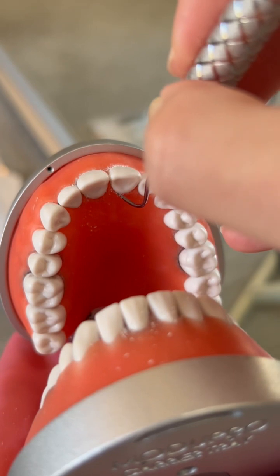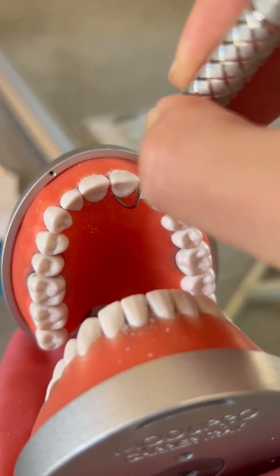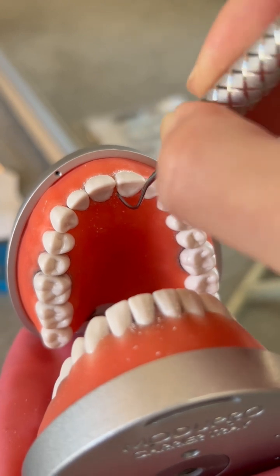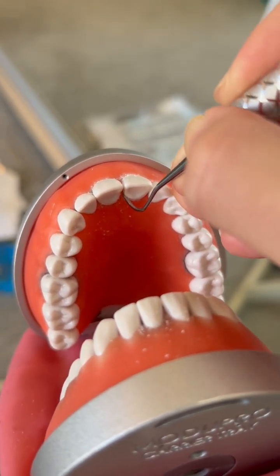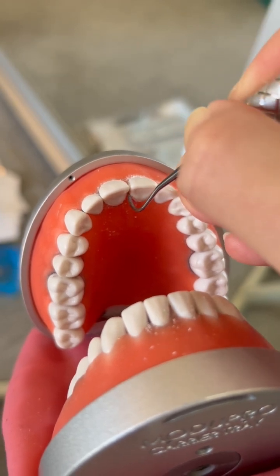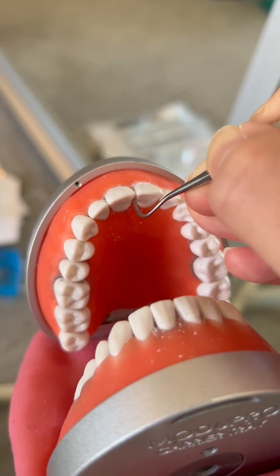And then same with tool number 9. Start at the midline, side to side, pivot and roll, side to side, pivot and roll. Only go half of the interproximal space.